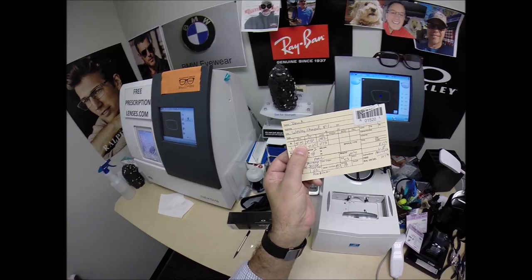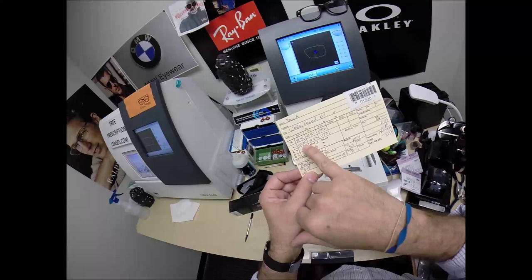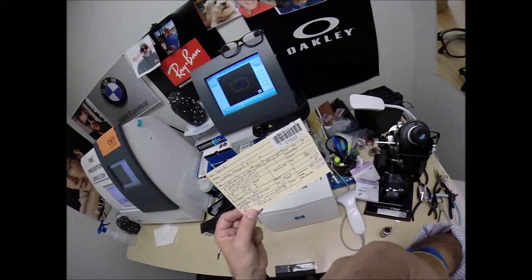Now you are not a simple hyperope, that would mean you have no astigmatism correction. You are a compound hyperope so you have plus here and minus here. So once everything is the correct size we have to take away those fuzzy edges which that dreaded astigmatism creates. So that's why sixes and eights look alike or the letters P or F. But I got this for you astigmatism and I'm going to turn that to 82, literally the old this and that. That's how we knock out astigmatism, we check that second curve, we end up at plus a quarter.